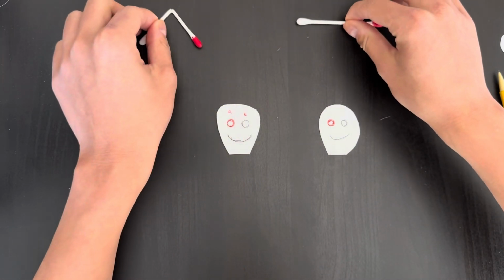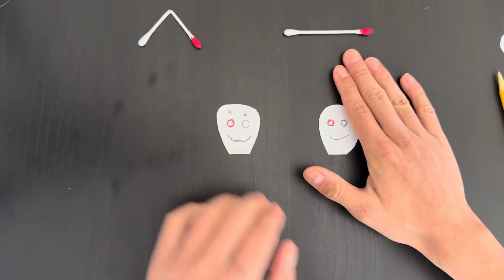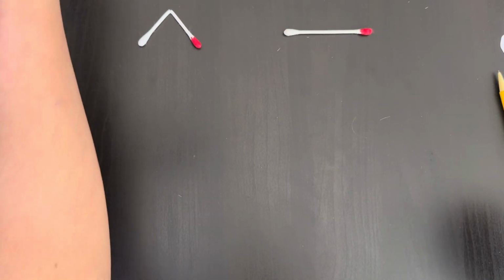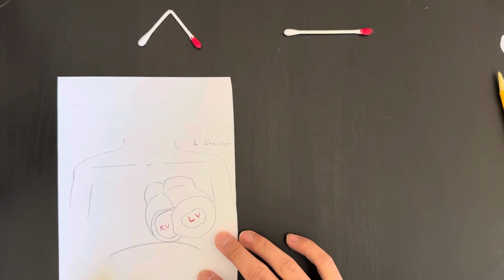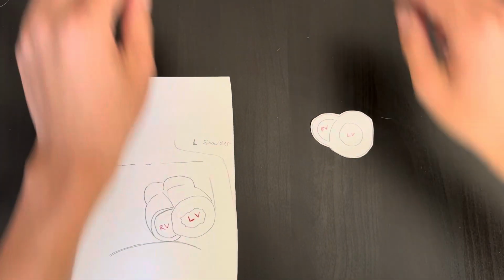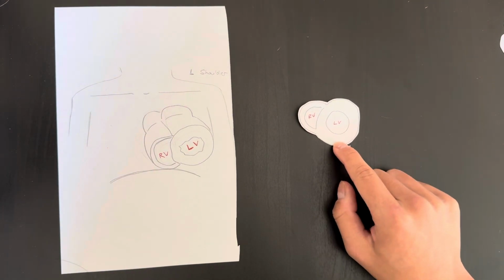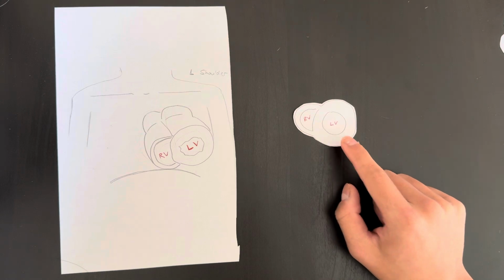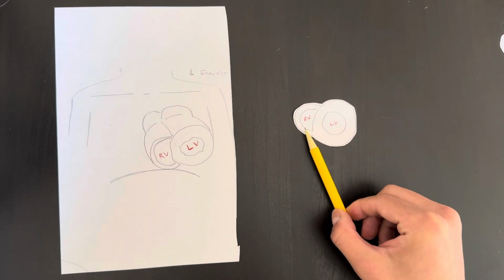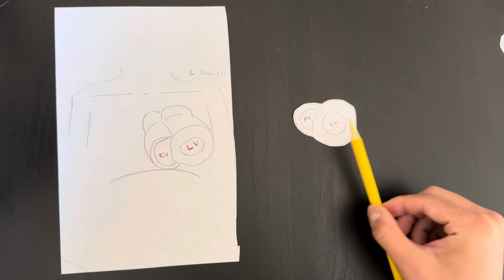So let's do the same example where this is the patient and this on the right side is the output on my screen, all right? So let's start with a parasternal short axis, okay? This on my screen is exactly what I want to see. Whether I'm a radiologist, an emergency physician, or a cardiologist, I want to see on my screen my right side being the LV and my left side being the RV. And I expect to see something bigger on my right side.